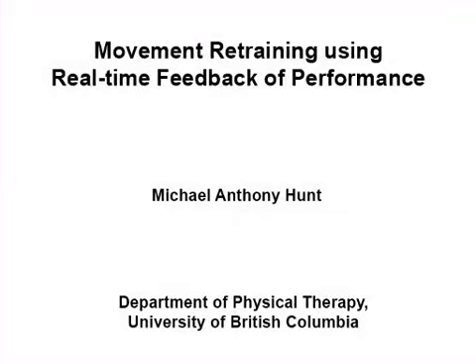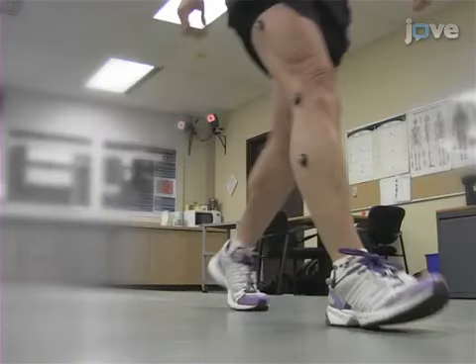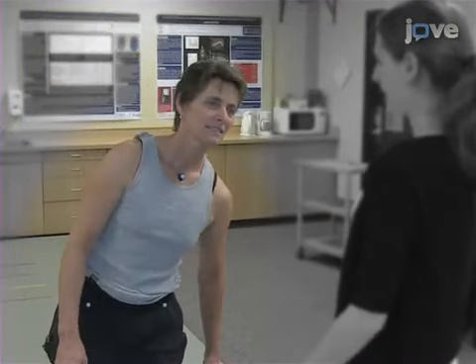The overall goal of this procedure is to collect, analyze, and display relevant human movement data in the shortest time possible. This is accomplished by first conducting a baseline movement analysis session to determine normal movement characteristics. The second step is to determine which movement characteristic will be modified based on the analysis of normal characteristics.